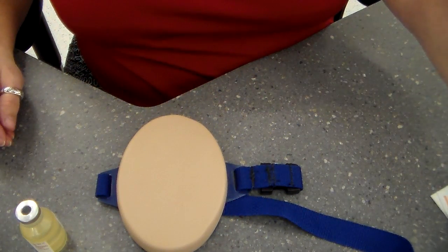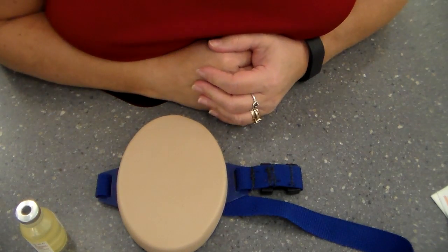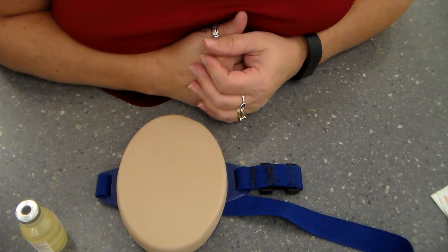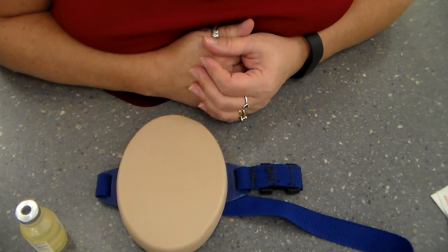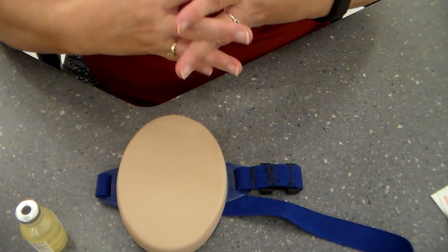So this is skill 2.38, administering subcutaneous injections. Obviously, in order to administer subcutaneous injections, you're going to have to do this in the patient's room. Prior to that, in the medication room, you're going to take out the medicine from the storage.